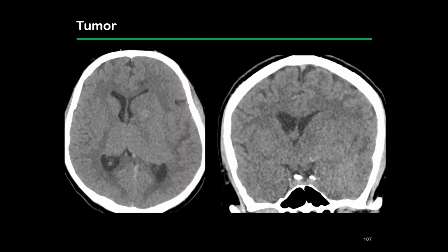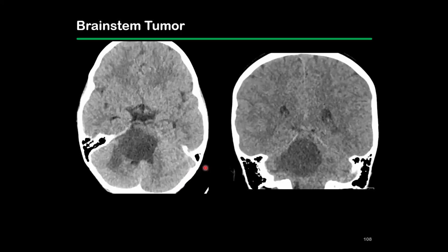Low-grade tumors may not enhance, so you may not get as much benefit out of a contrasted CT versus a non-contrast CT. Typically, they'll go on to MRI to get a better look. This is a different tumor, a brainstem tumor. They're a little bit easier when they're not the same density as the brain. So this was a more hypodense mass involving the pons, extending a little bit into the right cerebellum. This was a diffuse intrinsic pontine glioma.